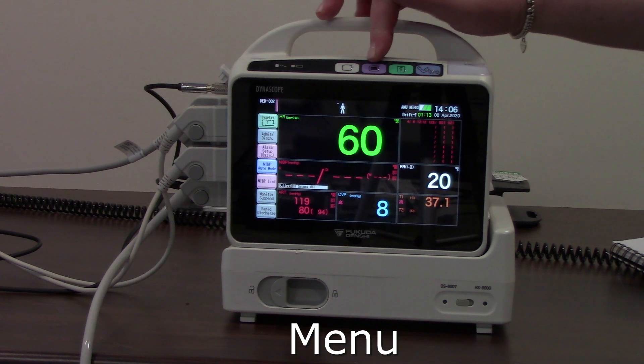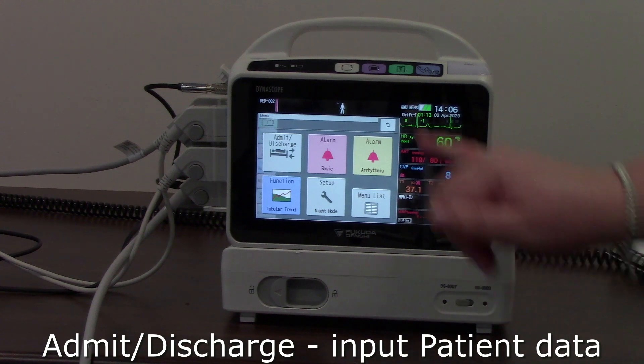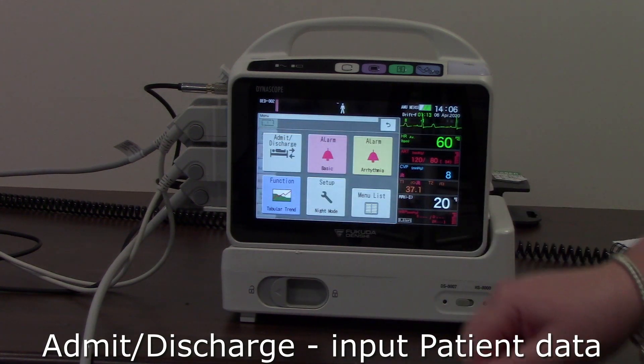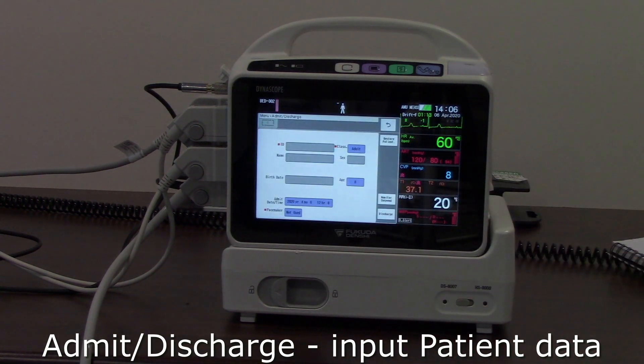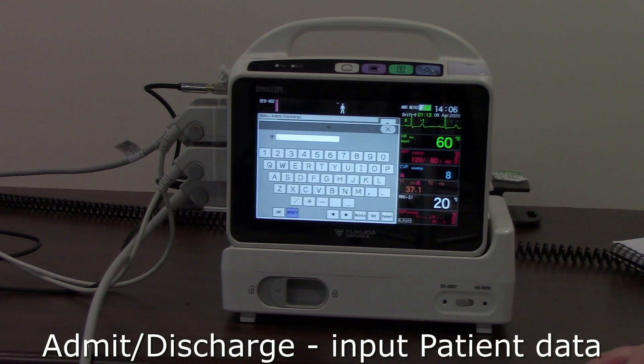The next button along — the purple one — is your menu key. This will bring up a menu for the monitor. In here we can see an admit/discharge menu where we can input our patient data.